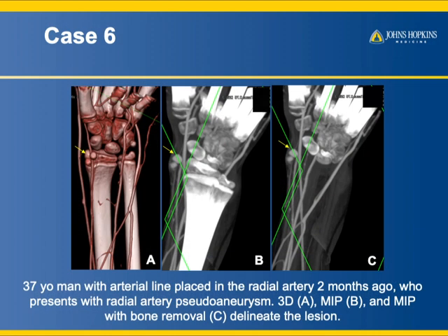Another example: a patient who had an arterial line placed via the radial artery now has a radial artery pseudoaneurysm — almost a bilobed pseudoaneurysm. Bone removal is critical, especially with MIP, but with any technique it makes the images so much better.